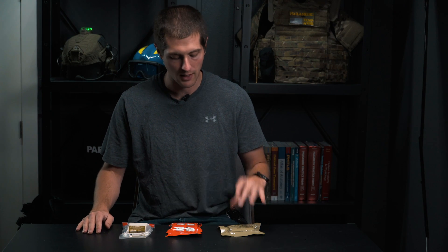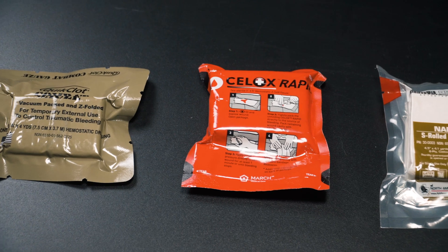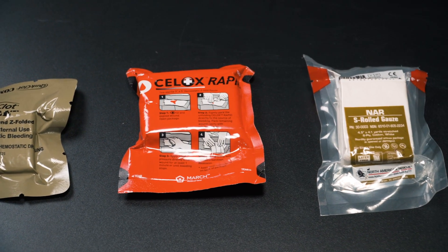Having a hemostatic agent such as Combat Gauze Quick Clot or Cellox Rapid Ribbon has been kind of a tactical intervention, but there is a lot of misinformation about this gauze, especially when it's compared to regular packing gauze. I wanna go in depth a little bit on what these gauzes do, what their capabilities are, and what we've shown with peer-reviewed research.